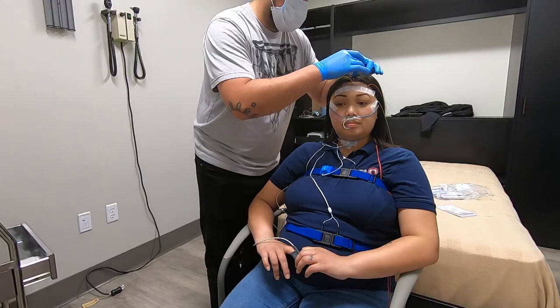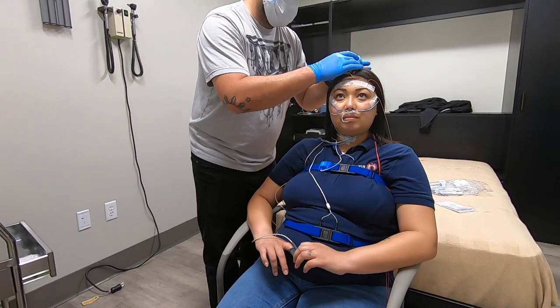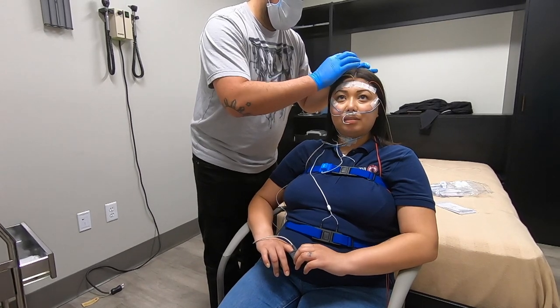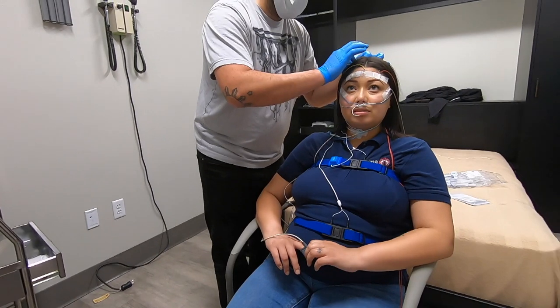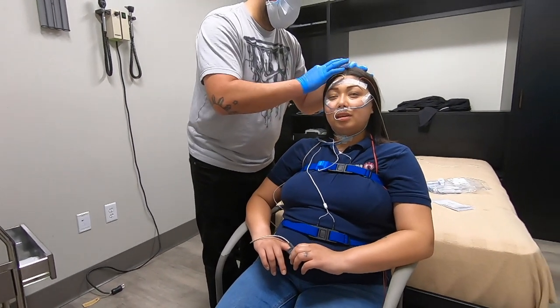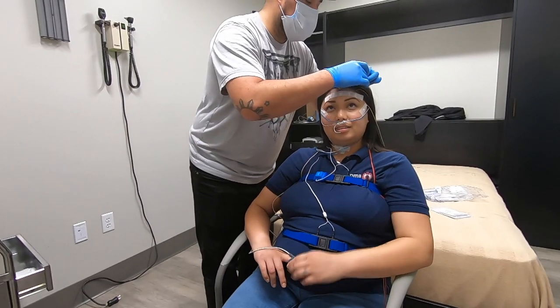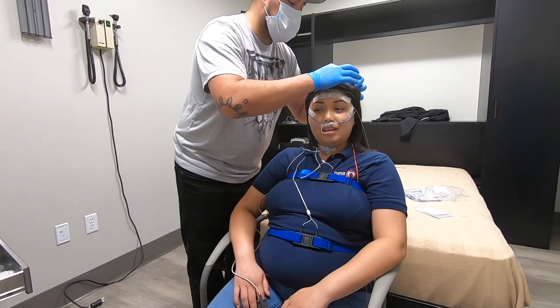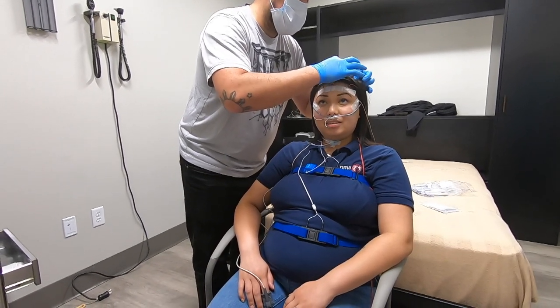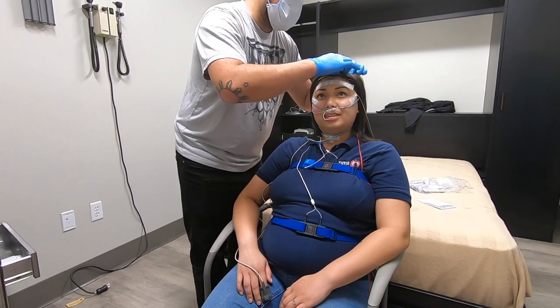What do you think so far, Kirsten? I feel like a robot. Are you really aware of all the wires and everything on you right now? I lost count. Only the ones in my nose — those ones you're still really aware of? And this belt. Both of them or just that one? Just this one. Do you want to loosen it some? No, it's fine. I just don't like feeling restricted.